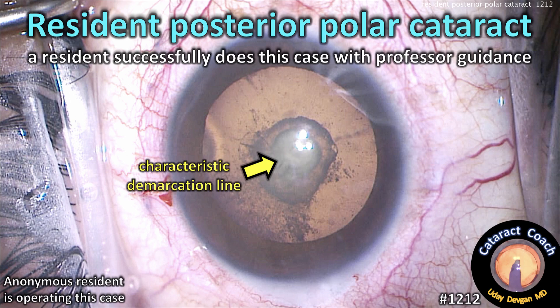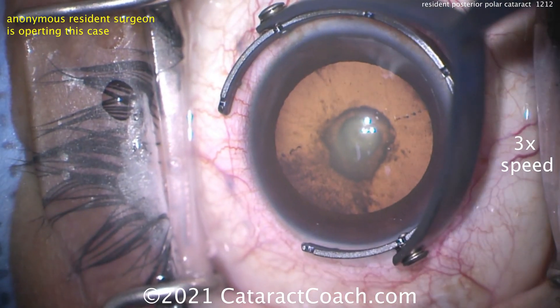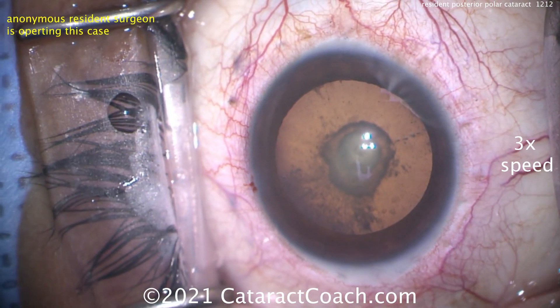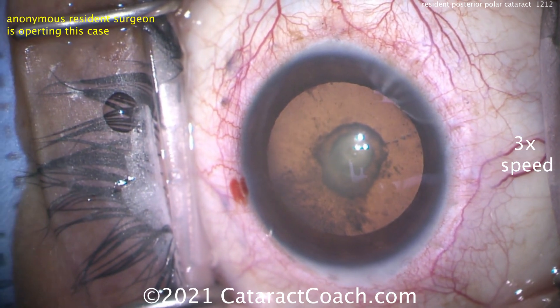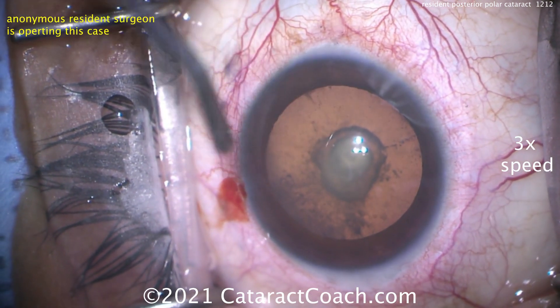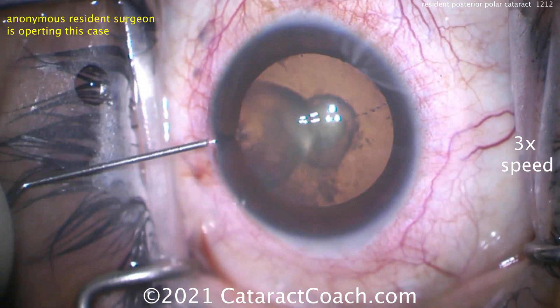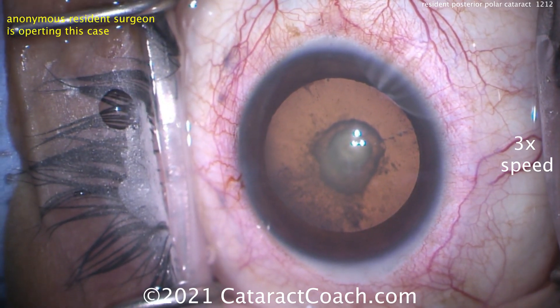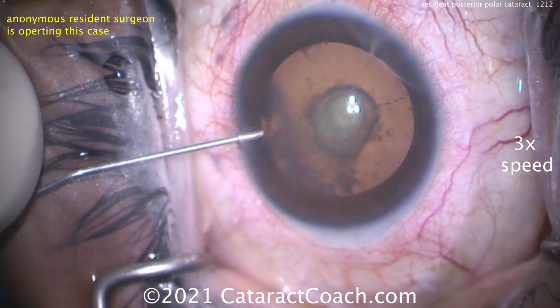CataractCoach.com — a resident successfully does this posterior polar cataract case with professor guidance. That's a tough case. Now look at that characteristic demarcation line. There's some PSC cataract, but look in the very center — that round, well-circumscribed area with a strong demarcation line. That's the posterior polar opacity, present by the way in both eyes. The patient is also on the younger side, only about 45 to 50 years old.